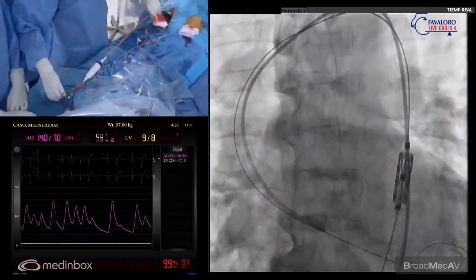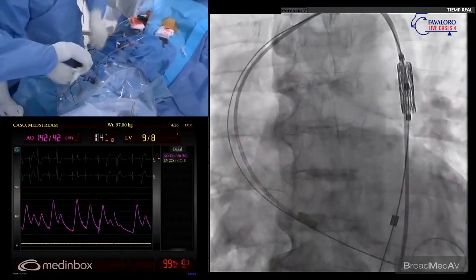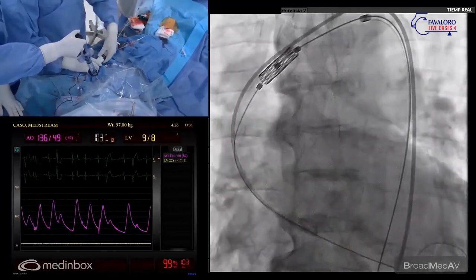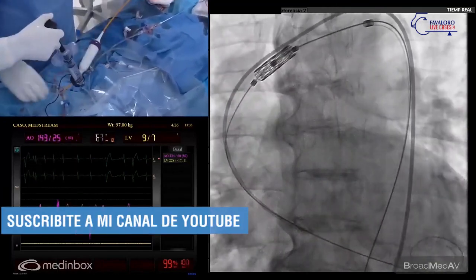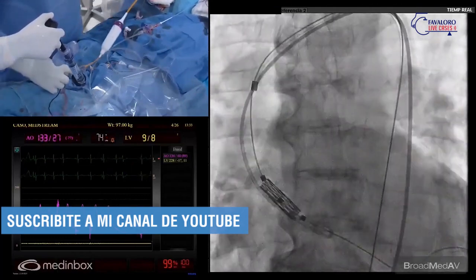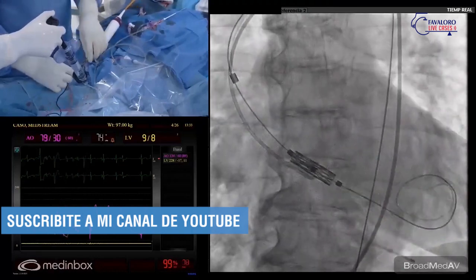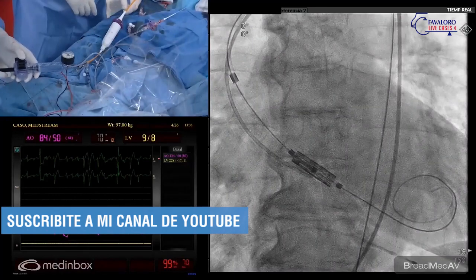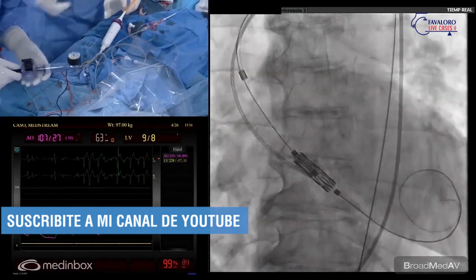So at this point, we deflect 50%. Now we are deflecting, and deflecting a little bit more, to cross the valve. And now we are almost in. Great, great. So now we will pay attention to the position.